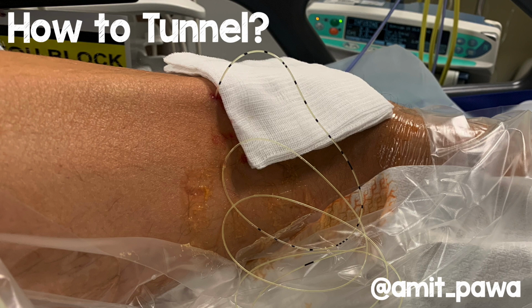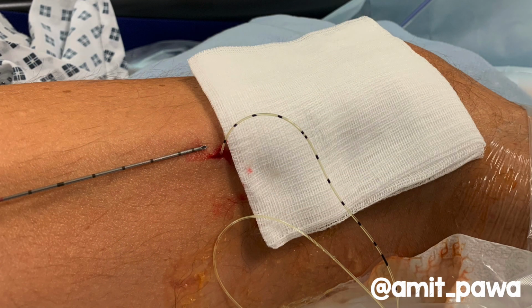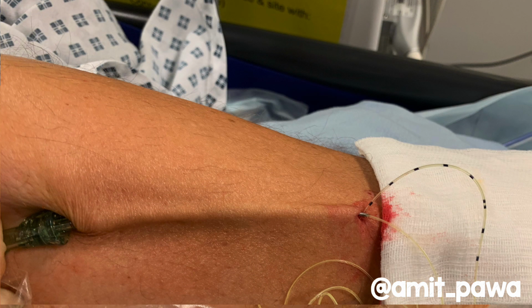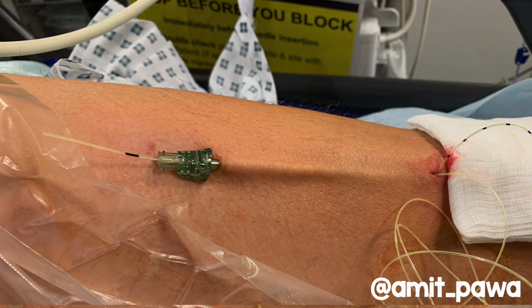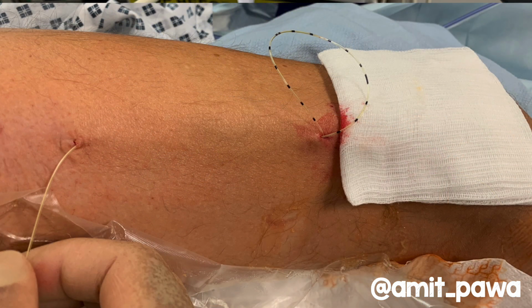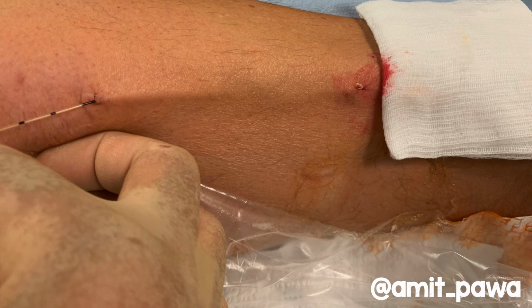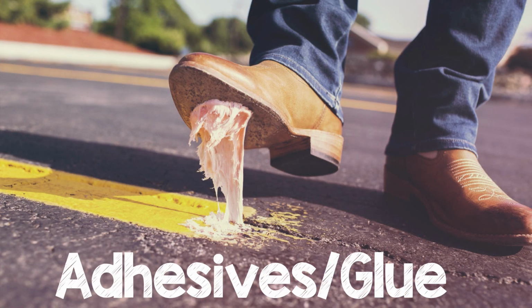So my catheter has emerged now as a popliteal sciatic, and then I'll make a little nick right next to the catheter. I then take the needle and tunnel it right next to the catheter. I protect the catheter, and then I pass the catheter in a retrograde manner back up through the shaft of the needle, and then pull the needle out, just waiting to see it disappear. You can see that little loop, and it'll pop underneath the skin, and when it disappears, cover that with a bit of Dermabond. So that's how I tend to do that.